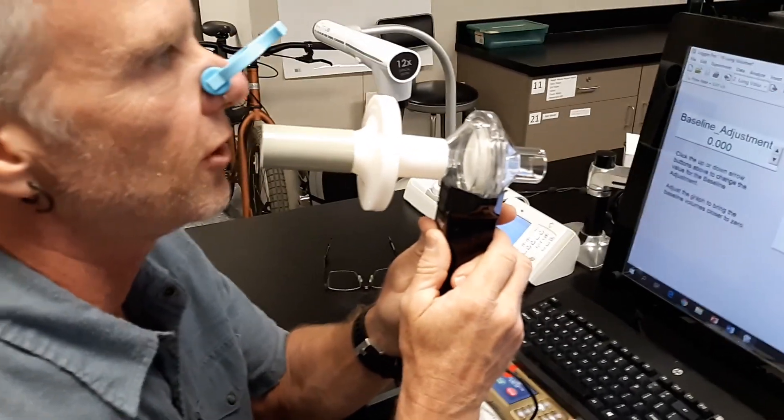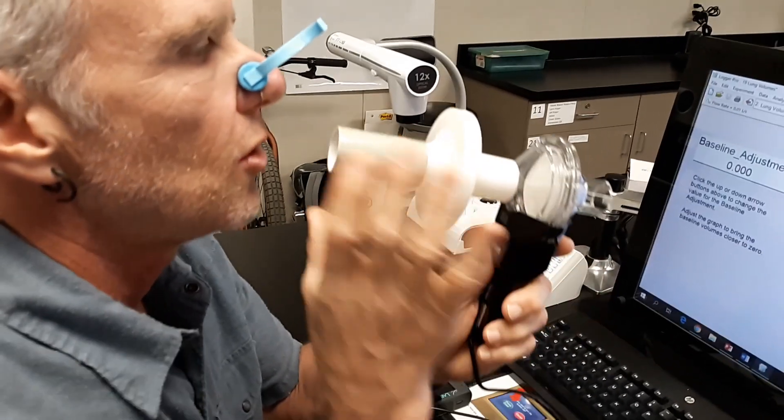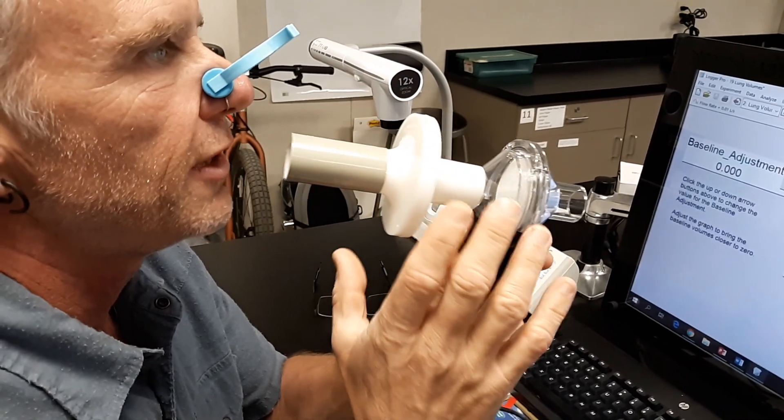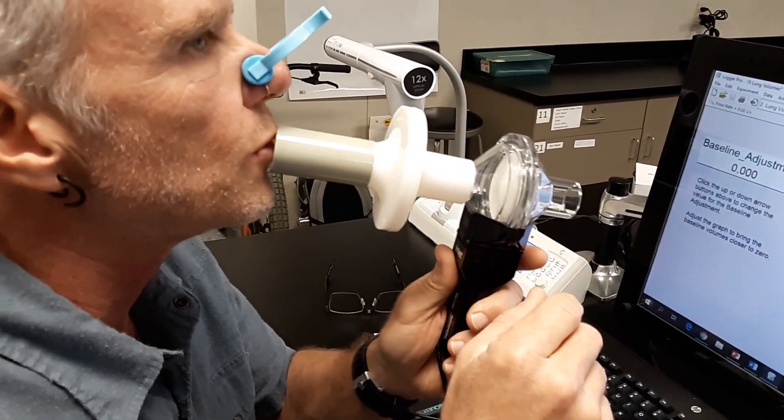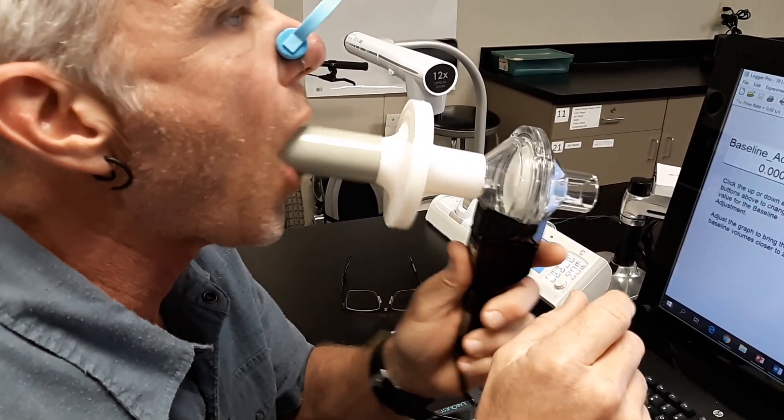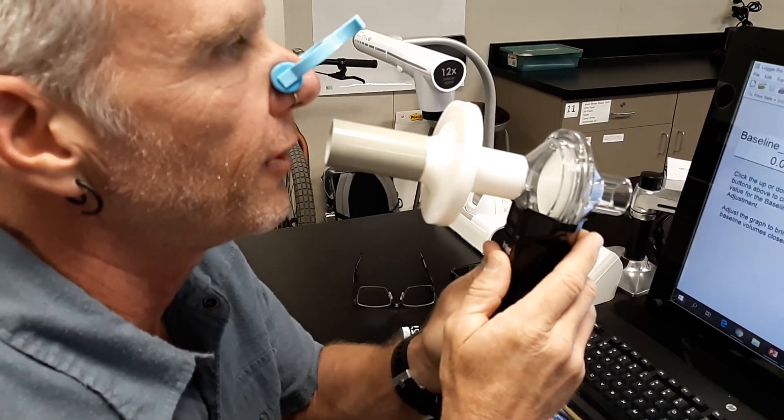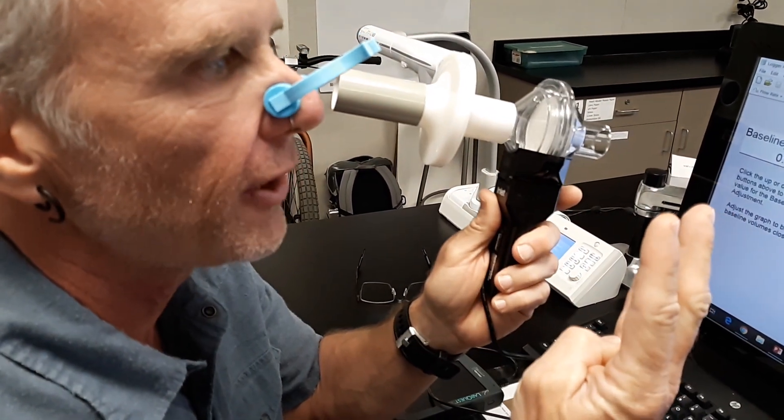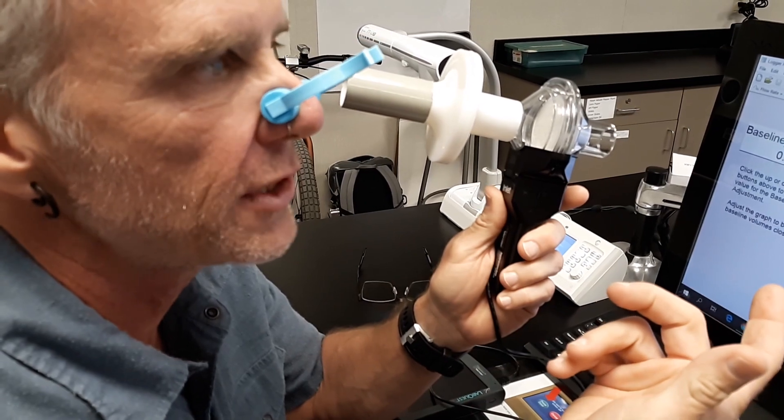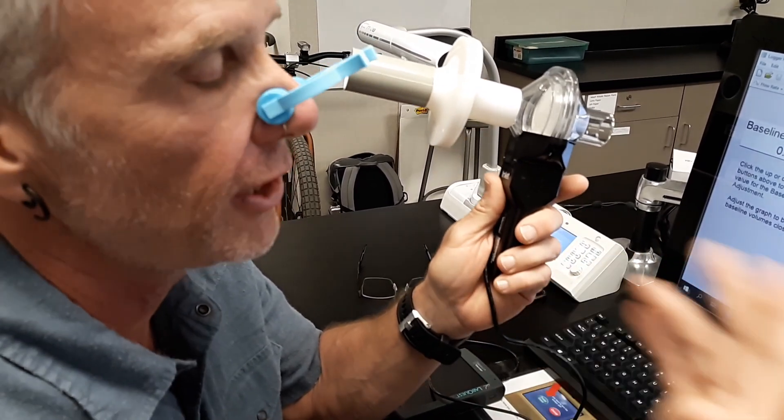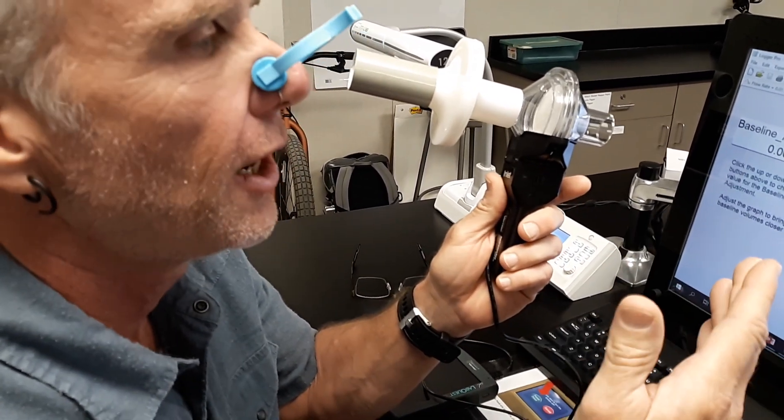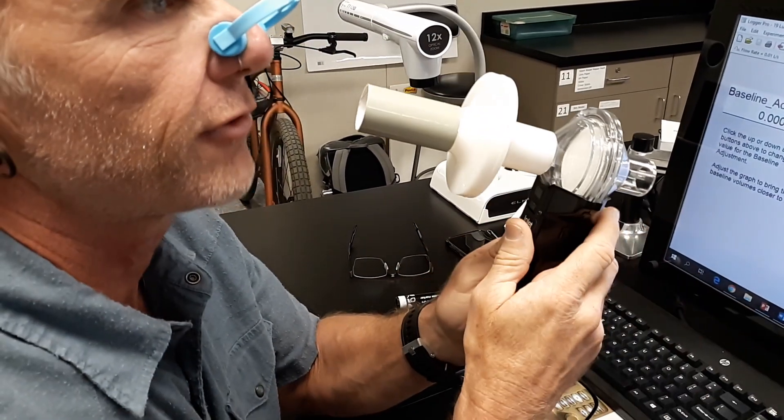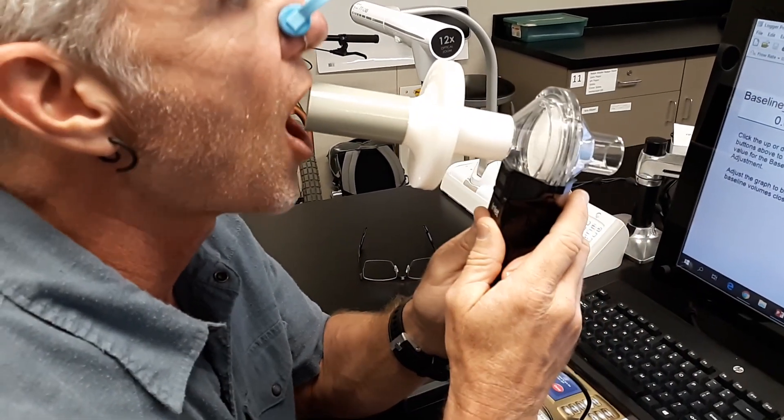All right. So let's go ahead. We're going to go ahead and start this. And when you go ahead and breathe into this, you don't want to just breathe in like this and you want to put your mouth all the way around it. All right. So here we go. I'm going to take four regular breaths and then I'm going to hold my breath for 20 seconds. If you can do it for 40, great. I'm old. I can't. And then we're going to take four regular breaths after that. All right, here we go.